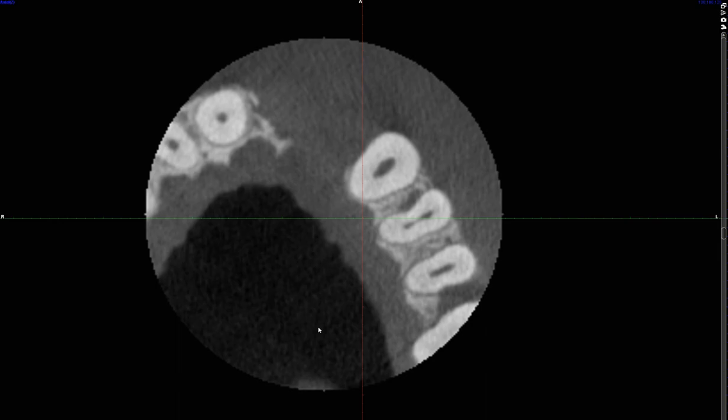Hi everyone. I want you to think of two questions as I scroll through this axial view of the CBCT volume. First question: why was this being taken? Second question: which tooth has a proximal caries? I want you to think of that.